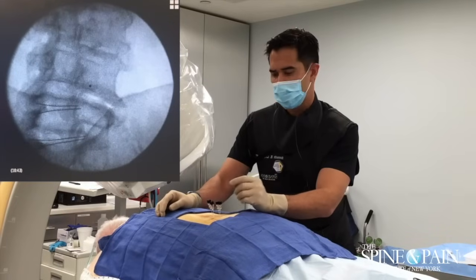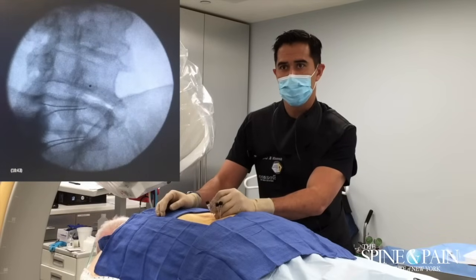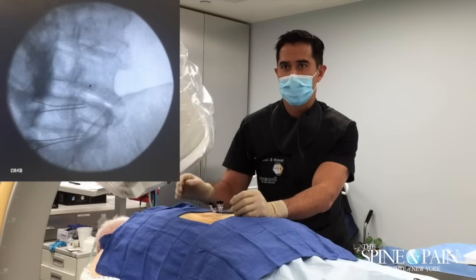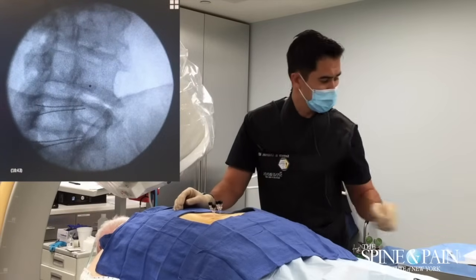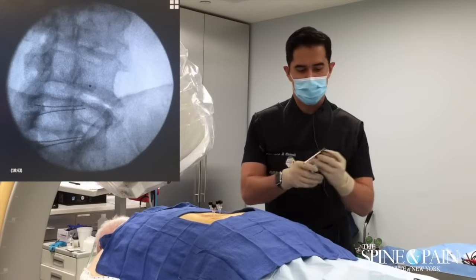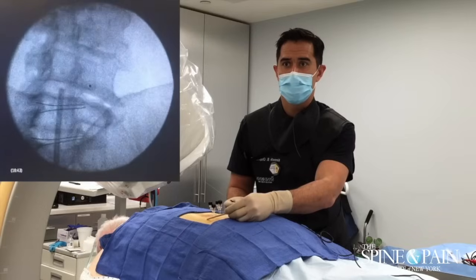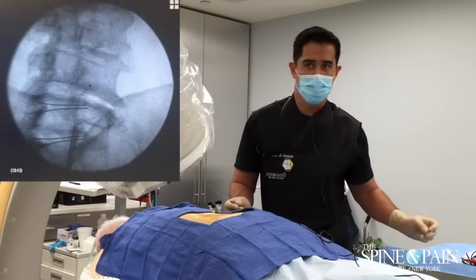You can see how maneuvering these needles to lie kind of parallel to each other — about the half centimeter mark or so. At that junction is where that nerve comes down and wraps up. You can see the line adjacent to where we are is the actual facet joint. This line right here at the L5 level — that is the actual facet joint.